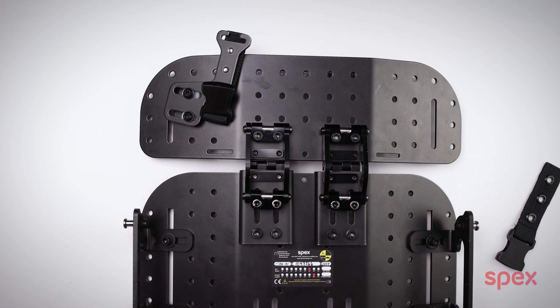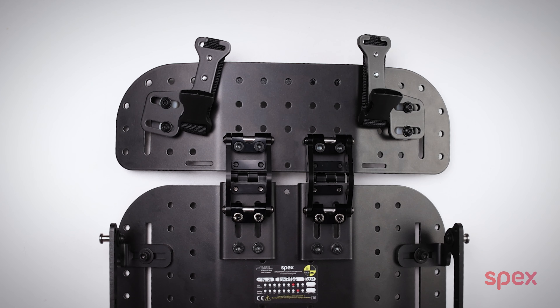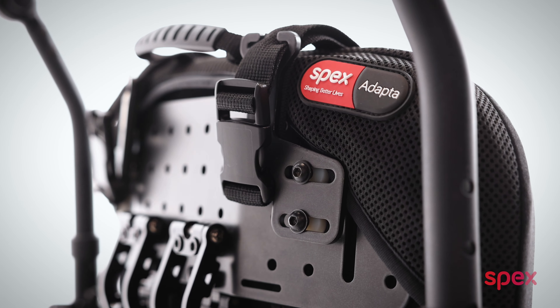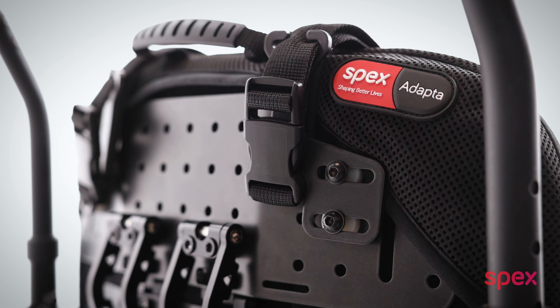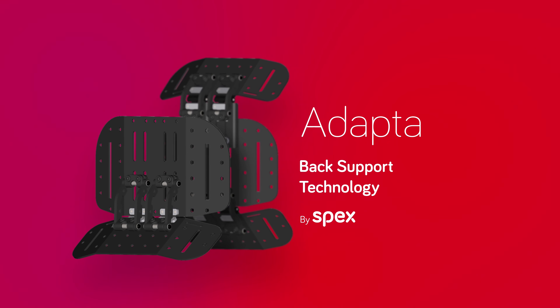Do the exact same thing on the other side like so and it's finished. You have now successfully mounted the harness guides to the adapter. You can adapt it into the other side like that.